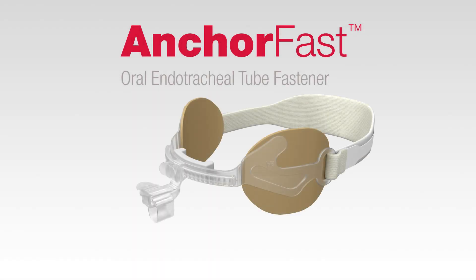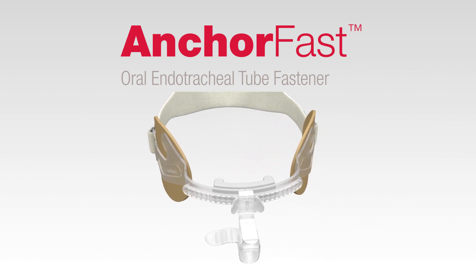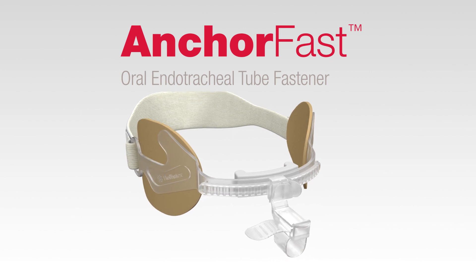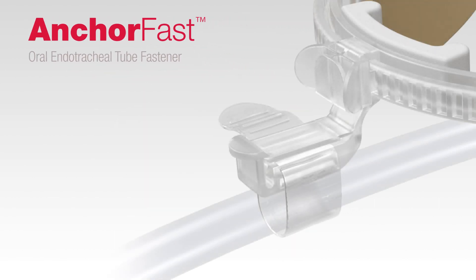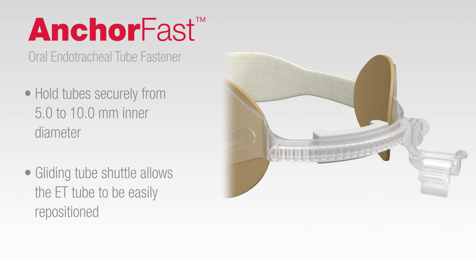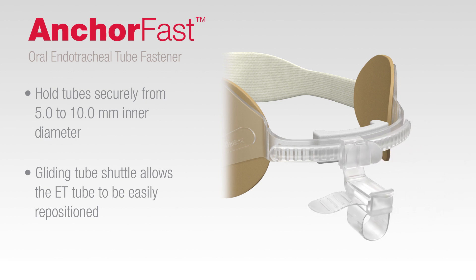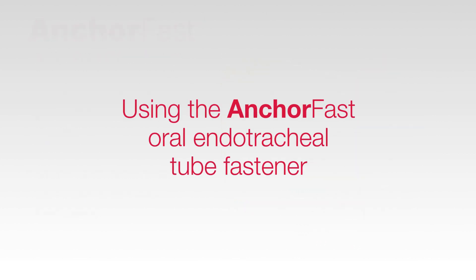The AnkerFast oral endotracheal tube fastener provides a convenient means to hold an oral endotracheal or ET tube securely in place without the use of adhesive tape. The oral endotracheal tube fastener allows repositioning of the ET tube in either direction along the track without removal of the device. The AnkerFast oral endotracheal tube fastener holds tubes securely ranging in size from 5.0 to 10.0 mm inner diameter. The gliding tube shuttle allows the ET tube to be easily repositioned from side to side without the removal of the device.